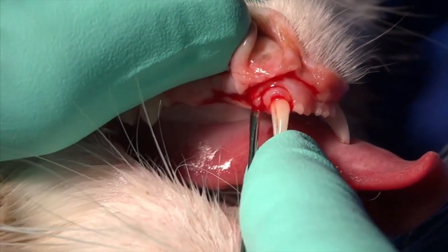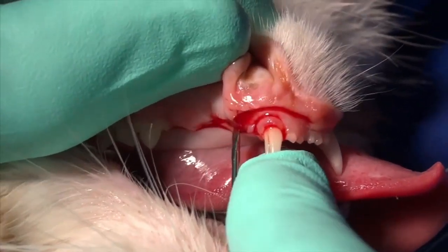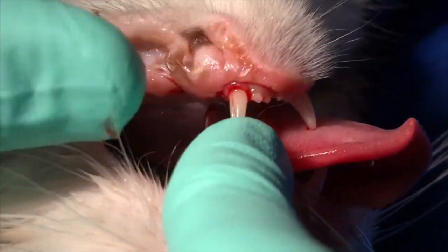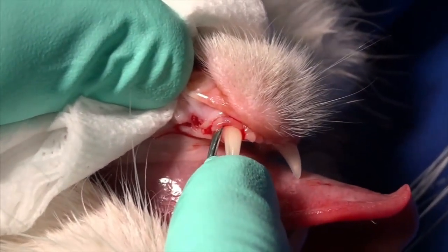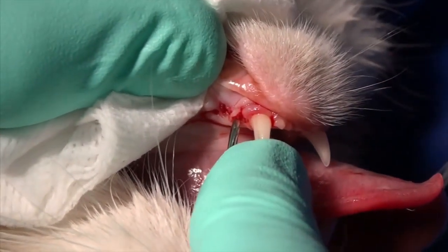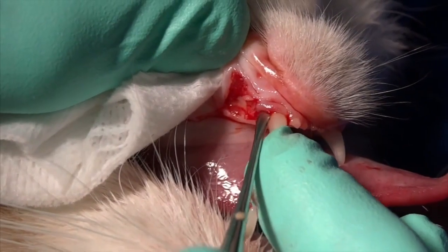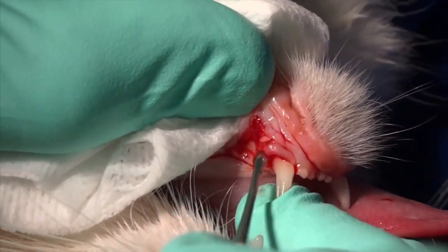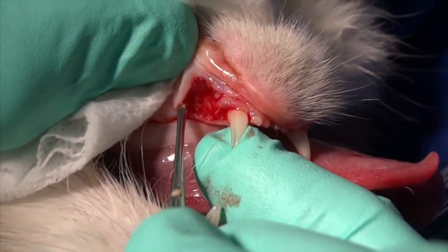As we loosen tissue throughout that whole margin, we'll start to work more aggressively to remove more tissue apical down to the middle mental foramen, which will be exposed. Then we'll take bone away from that area with a burr. Because of the resorption, there's a little bit of bone expansion from periodontal disease as well, so the tissue is more adherent and more difficult to elevate. There will be a small ding in the gingiva because of that, which will be excised at the end of the procedure — it's a very small area.